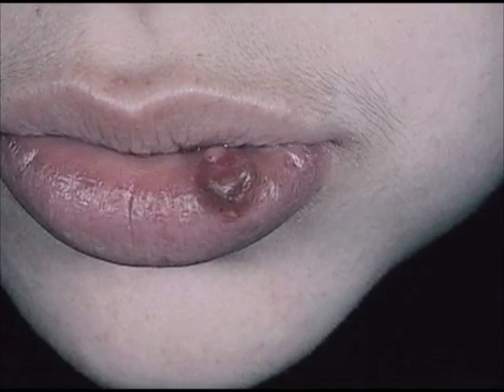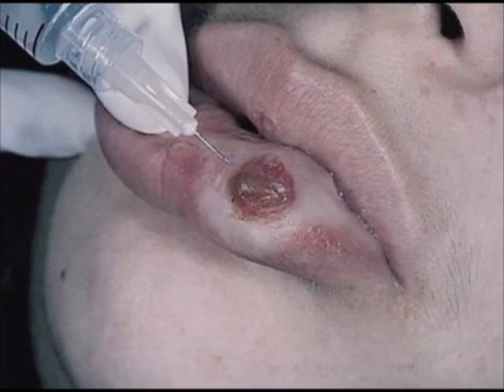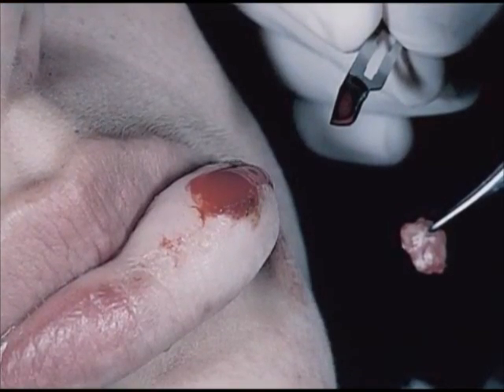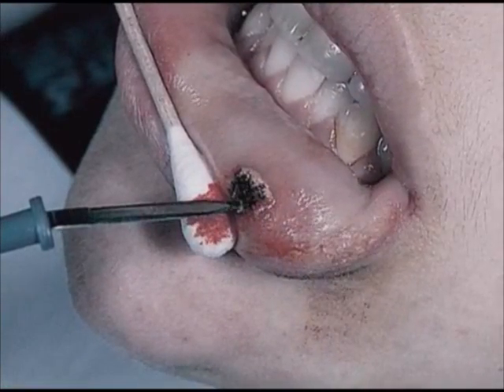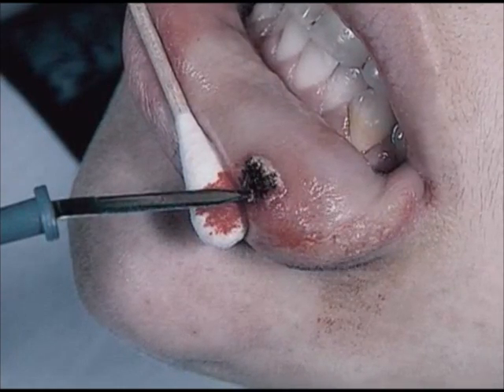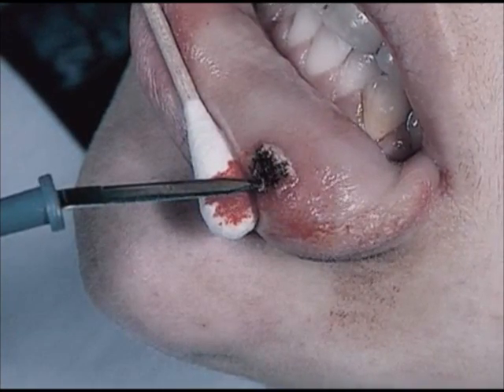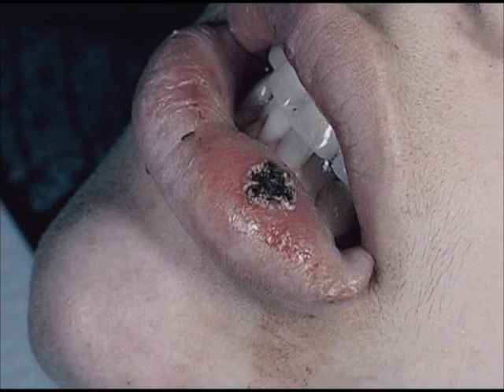These photographs show the treatment of a pyogenic granuloma on the lip that started in pregnancy. Here is the pyogenic granuloma. This next photograph shows vasoconstriction and swelling during administration of local anesthesia. The shave excision is completed with a number 15 scalpel. This image shows electrocoagulation with the hyfercator and a disposable electrode. Note that the cotton-tipped swab is rolled ahead of the electrode to dry the field immediately before the electrocoagulation.